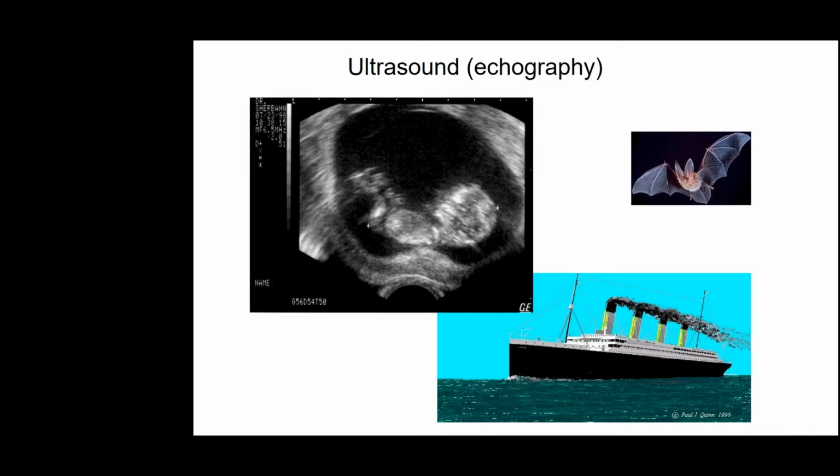If we know the speed of sound, which we know in tissue, then directly from that time we can calculate how far the obstacle that has returned the echo is, which helps us reconstruct images. It's also similar to the system that boats use to detect a school of fish under the water and at what depth, by emitting sound or ultrasound and waiting for the echoes to return.